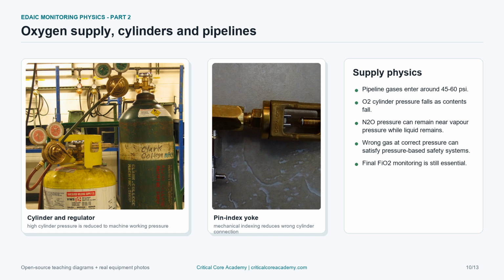Cylinder pressure falls progressively as oxygen is used. Nitrous oxide is different because it is stored partly as liquid. Its pressure may remain near the vapor pressure while liquid remains, then fall rapidly once only gas is left. That is why pressure gauges estimate contents differently for oxygen and nitrous oxide.